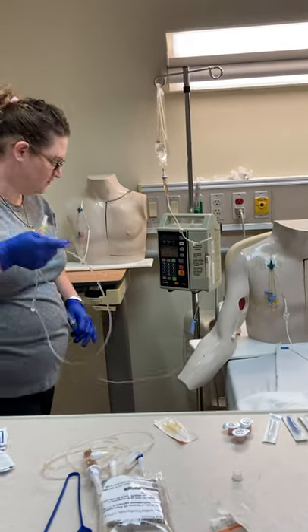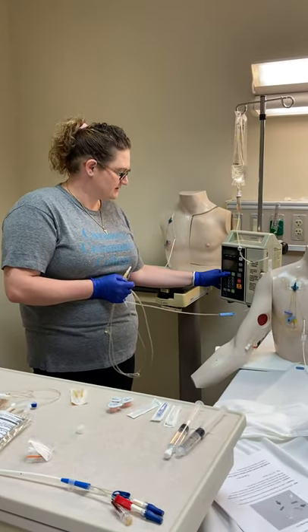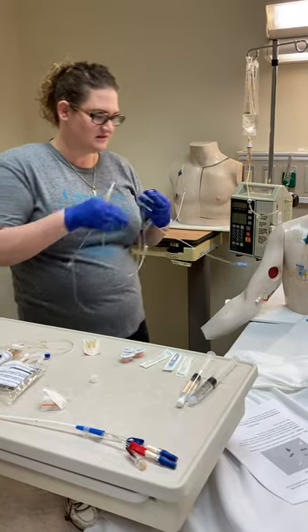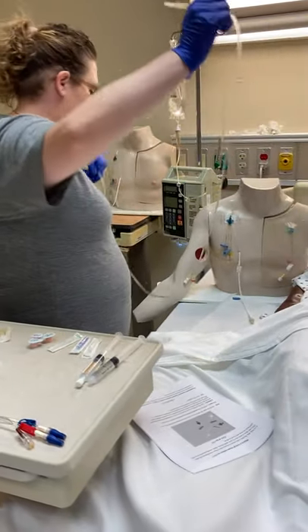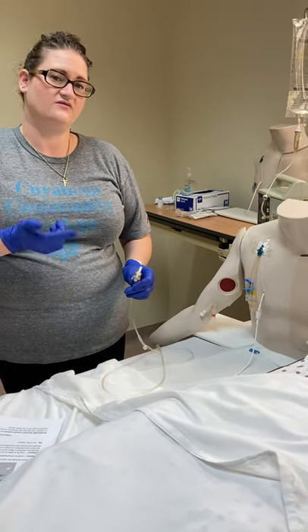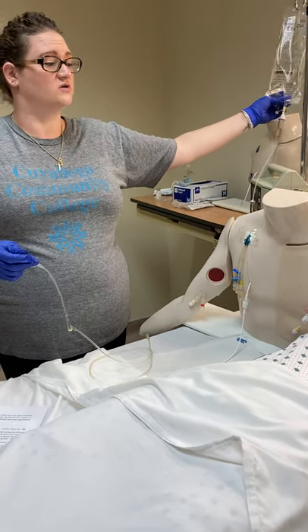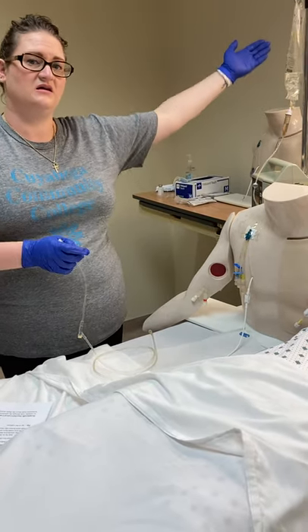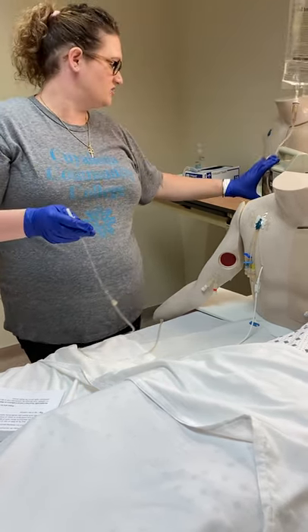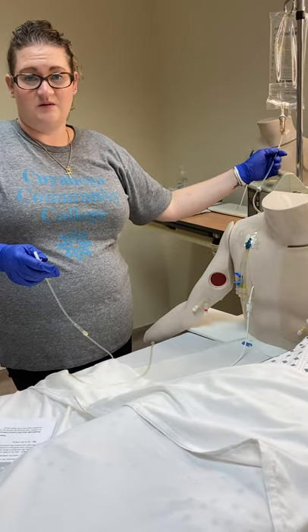I'm going to turn it on, set the primary rate to 75, and the volume to be infused is 500 milliliters. We've gotten our identifiers. We did our checks just like with our peripheral — making sure the fluid doesn't have any floaties, no signs of rips, tears, or leaks with the bag, it's not expired, and it matches the order for normal saline at 75 mLs per hour. We scanned the patient's band and the medication bag, and put date, time, and initials on the bag. Tubing is labeled with date, time, and initials as well.